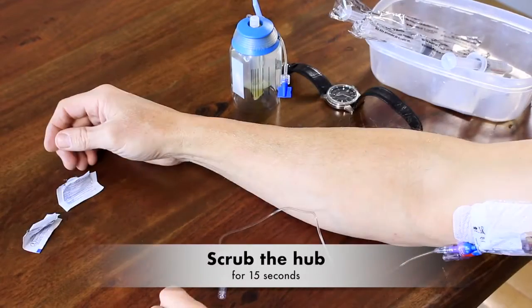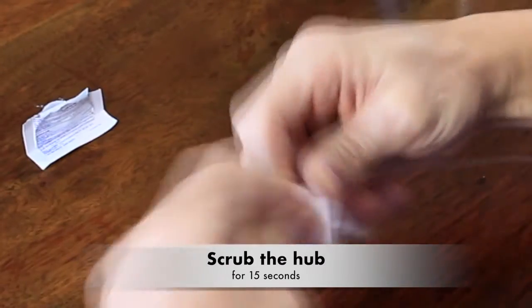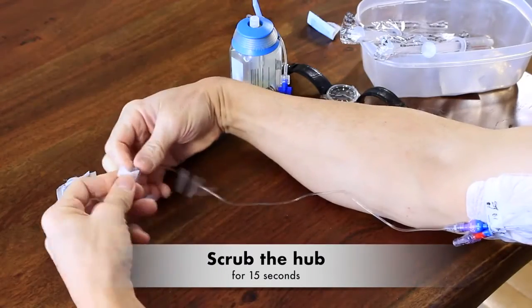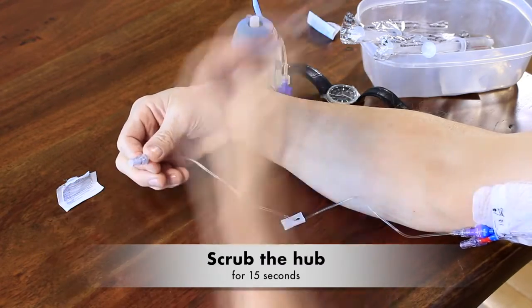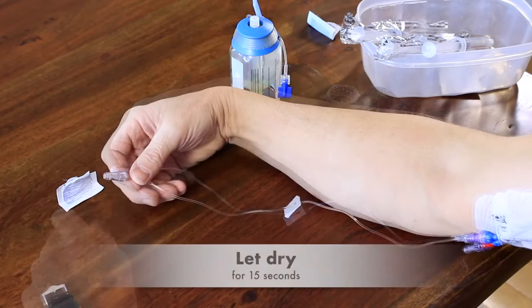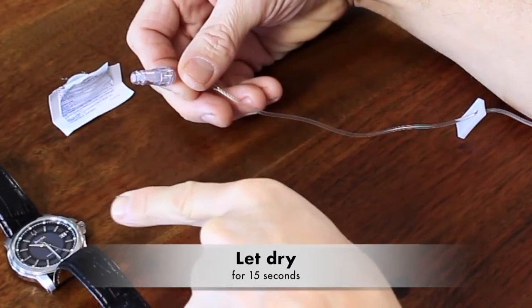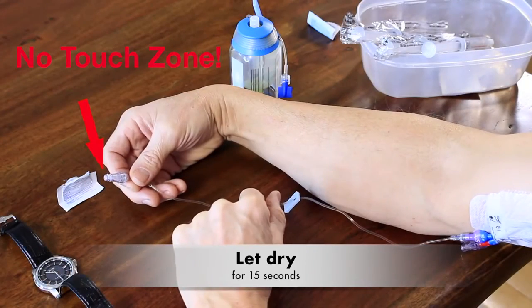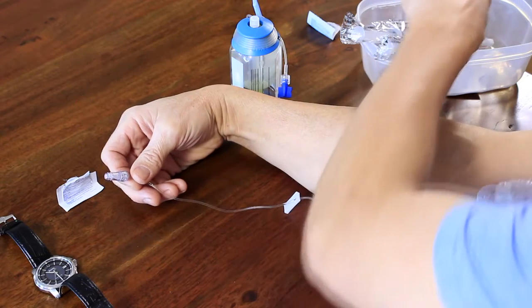Now you need to scrub the hub. So pick up the alcohol wipe and hold the cap in one hand and then scrub the end of the cap and the sides of the cap firmly for 15 seconds. Now you must wait for 15 seconds to let the alcohol dry and kill any germs. Now that it's cleaned, it is a no-touch zone. You have to make sure nothing touches this clean cap, and if it did, you would get another wipe and clean it again.